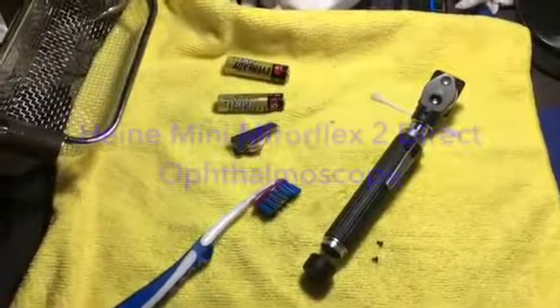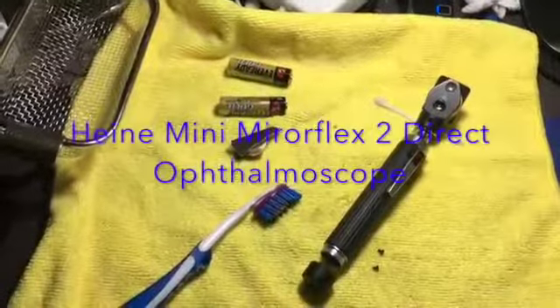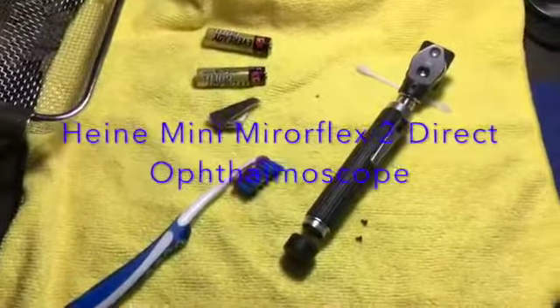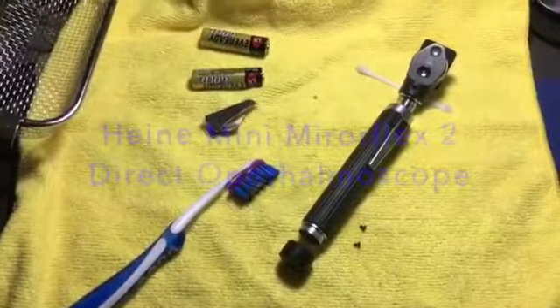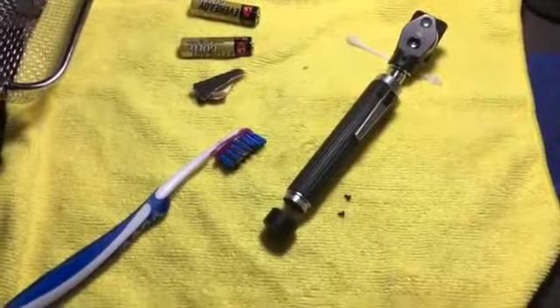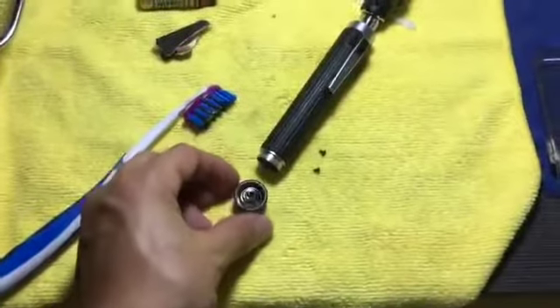Hey YouTubers, this is JeromeX. Today is a slow Saturday so I decided to service my Heine Mini Mirror Flex 2 direct ophthalmoscope. It's been standing in the cabinet for a while.